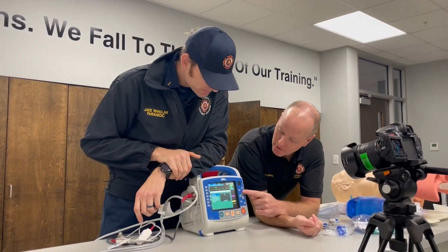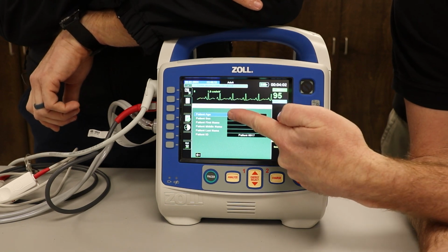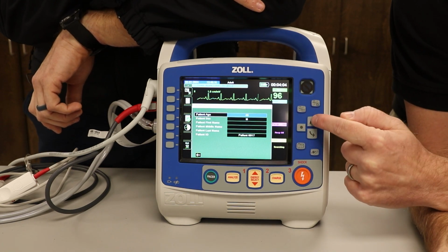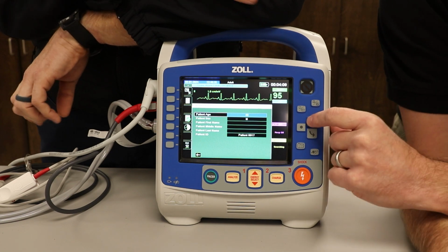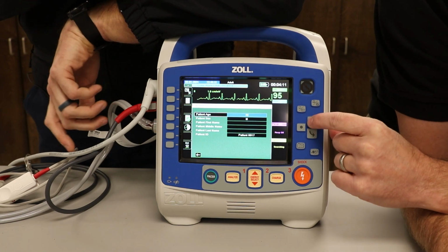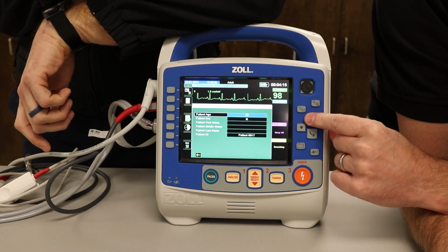Well, going back to your fancy little buttons here. If I was going to change the age, age happens to be highlighted. I'd push the button once, and then it's a simple up or down. So let's put my information in. You want to put my information in? Sure. And you're what, 22? I wish. 36. So I'm going to put you at 36.